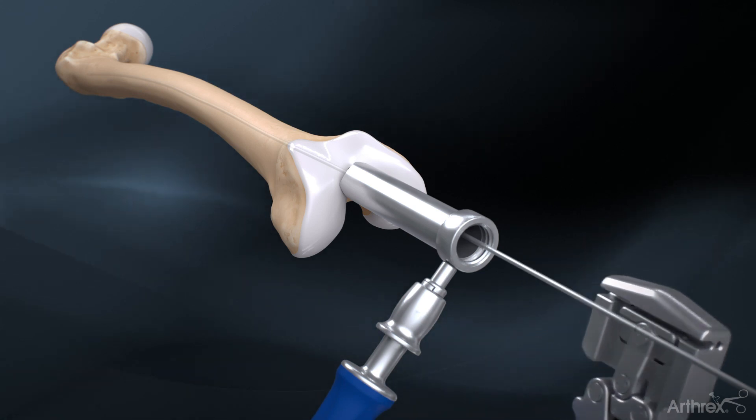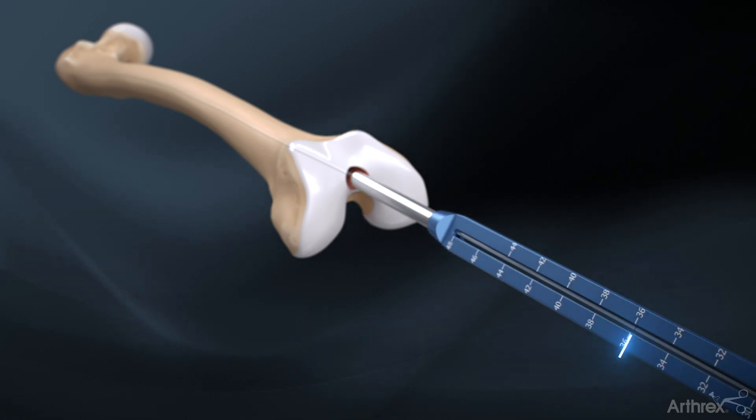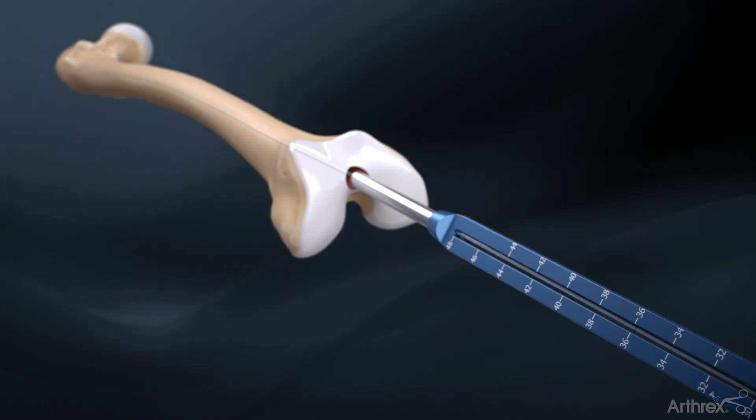Remove the soft tissue protector and measure the length of the ball nose guide wire with the guide wire depth gauge to determine the nail length. Measurement is taken at the black etch line.